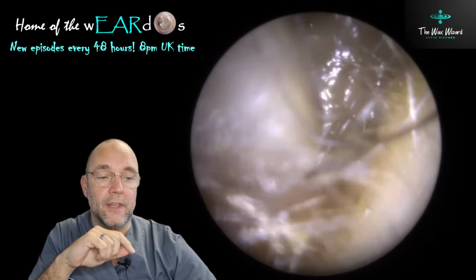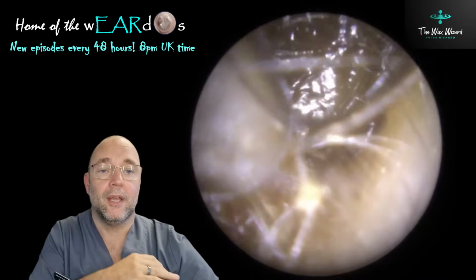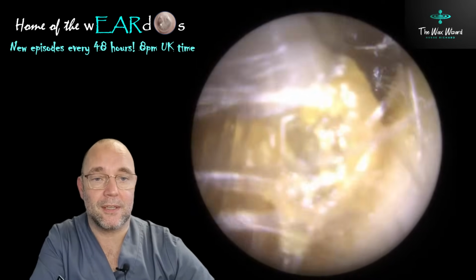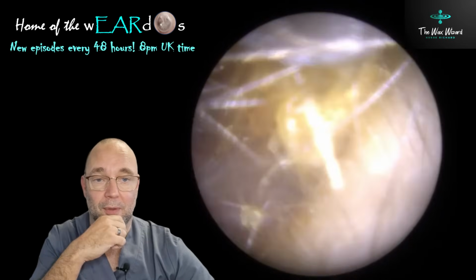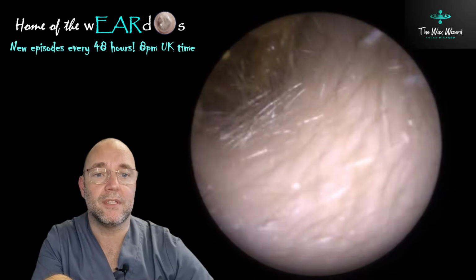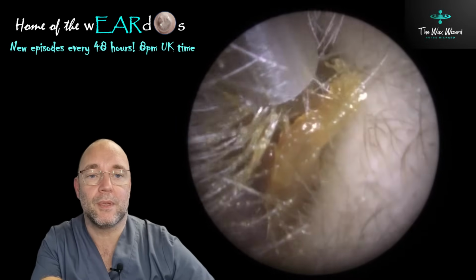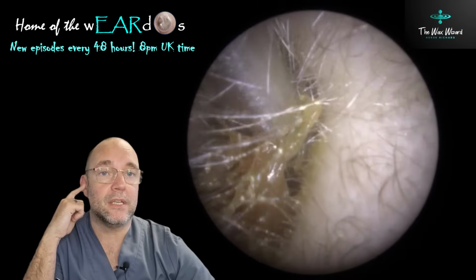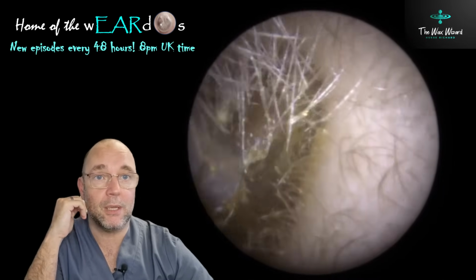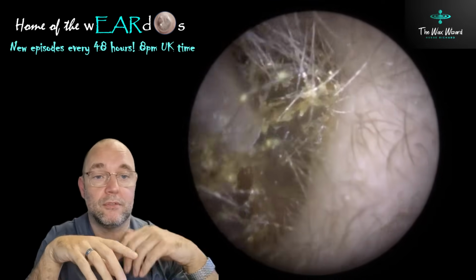Three of these 4 ears were a right battle. Hairballs. So it's like a bird's nest. That's kind of why I've titled the video that way. It can happen. It's usually men, to be honest. I think both of these, if I'm not mistaken, were ladies. Because when it's men, the reason is they sometimes trim the hairs on the outside of the ear, or even shave with clippers like I do on my head and my beard. It can just go flying everywhere and end up going in the ear.